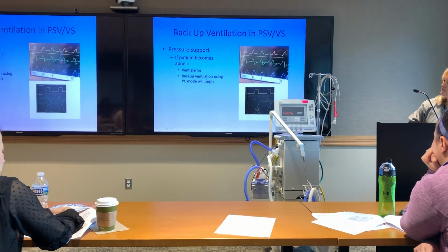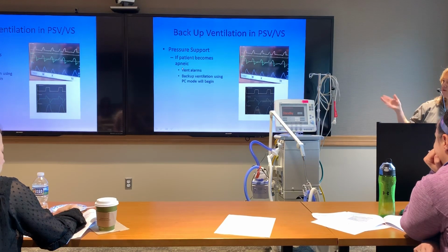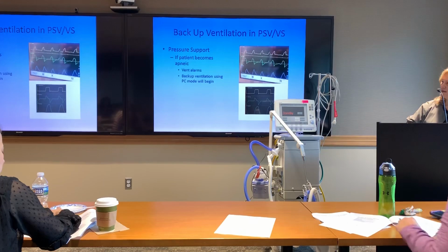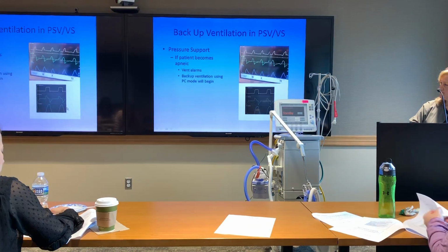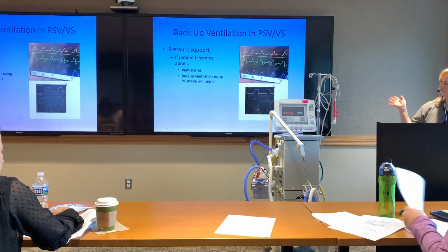All right, so if the patient becomes apneic, I've already talked about the vent alarms on that. Backup ventilation will kick in. So it'll go from this to this, which I've already kind of showed you, so that's good.